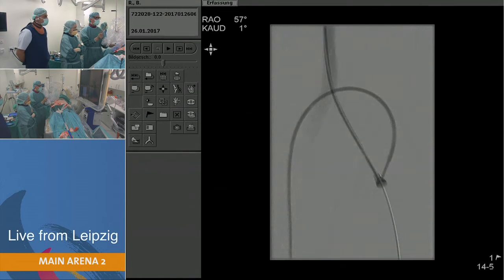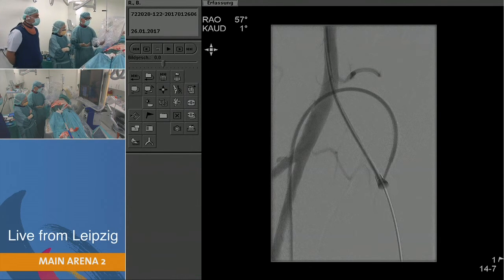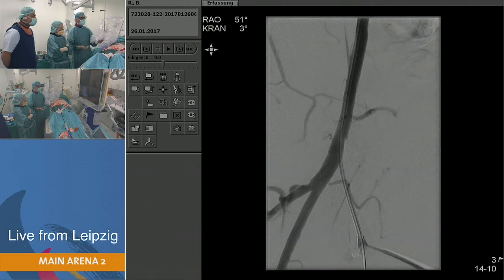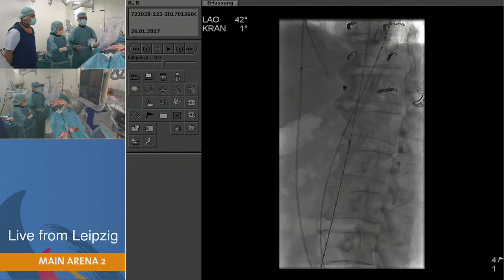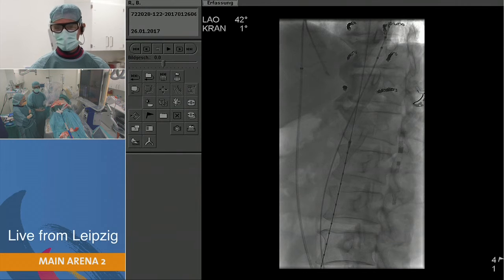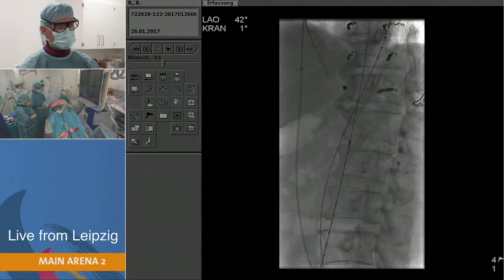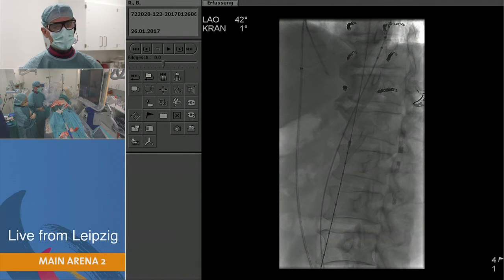Switching to the angio screen to show what we have done so far. First puncture was a little too high, so we repunctured lower into the lower third of the common femoral artery and closed the first puncture. We preloaded two ProGlides on the right side. We also performed an IVUS measurement to exclude any further aortic dilation, confirming our CT measurements. We are going to use a 34-to-30 tapered, 160-millimeter-long graft first.